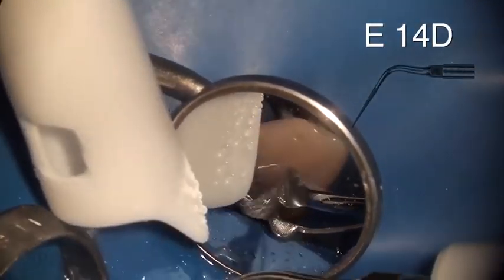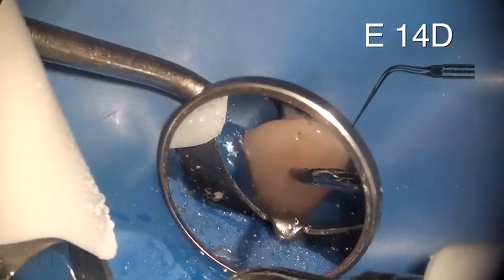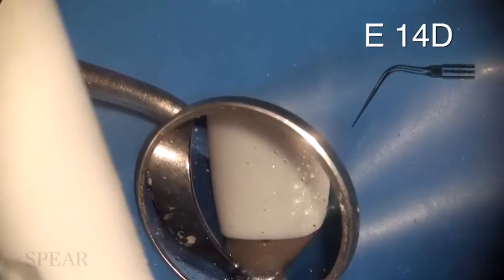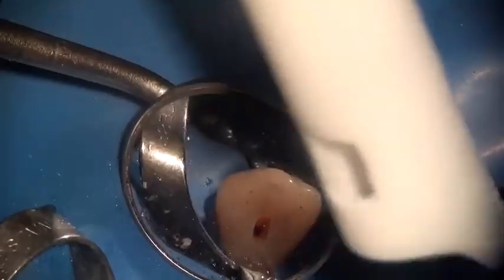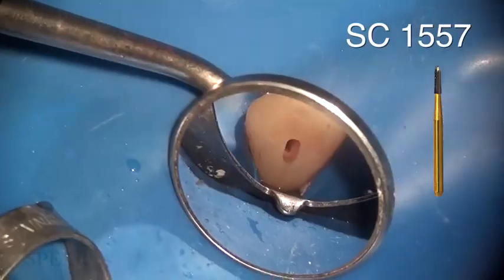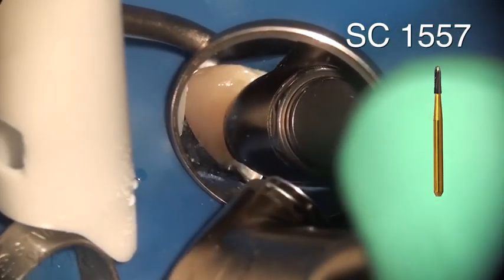As you saw very quickly, after we got through the enamel, we went through the dentin in a flash, and now I'm using that E14D ultrasonic tip with water to very quickly remove that smear of cut material. This is what I was talking about when I said you would use this in general dentistry too, because every time you cut dentin, you create that smear. The ultrasonic and water is the fastest way to remove it.